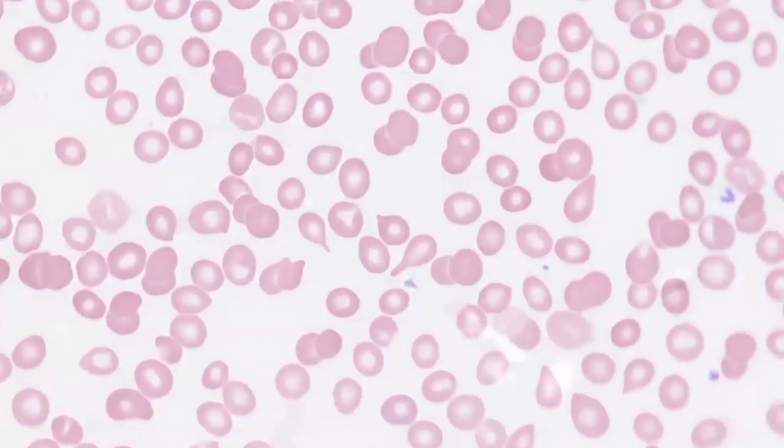Other times that you can see dacryocytes is when there's tumor infiltration of the bone marrow, when there's overproduction of some other cell in the bone marrow, and, as with this case, in fibrotic processes. Rare dacryocytes will be present in a normal peripheral blood smear. However, when frequent dacryocytes are seen in the peripheral blood, this can be an underlying pathology within the bone marrow.